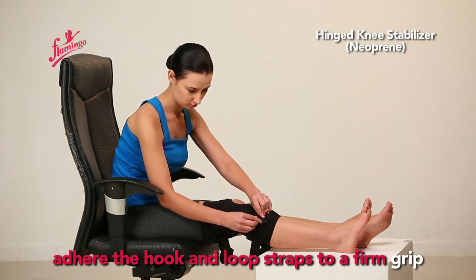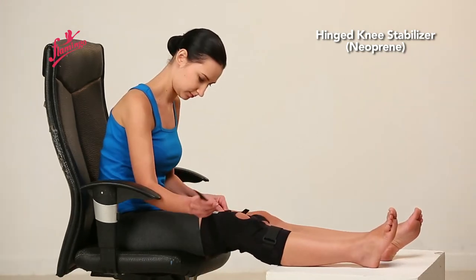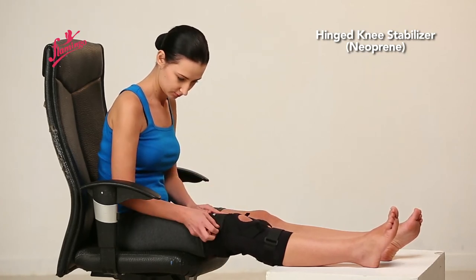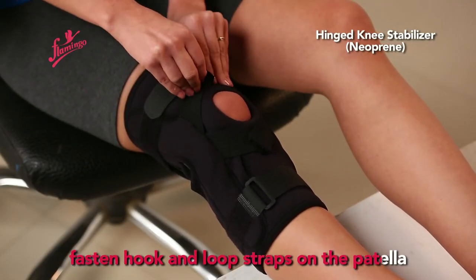Adhere the hook and loop straps to a firm grip. Fasten the hook and loop straps on the patella.